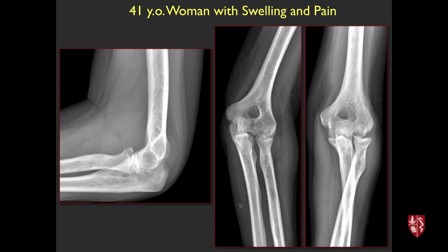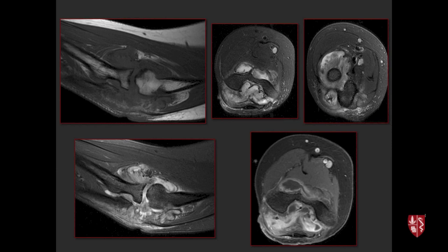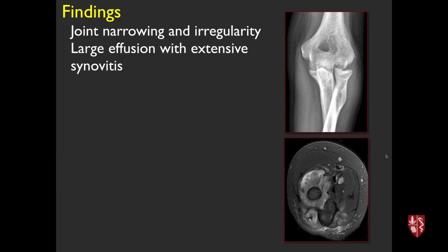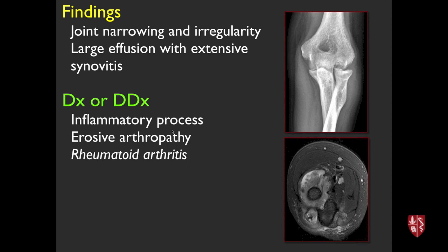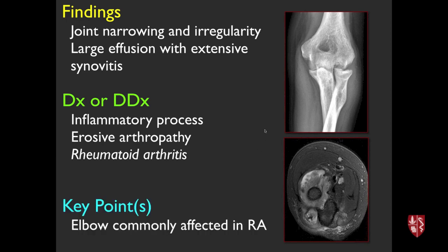41-year-old with swelling and pain in the elbow. MRI shows extensive synovitis at the radiocapitellar joint with a lot of fluid. This looks like an inflammatory, erosive arthropathy — this is rheumatoid arthritis, fairly common in the elbow.